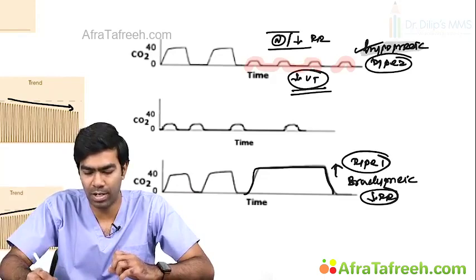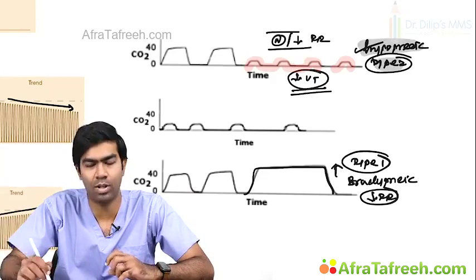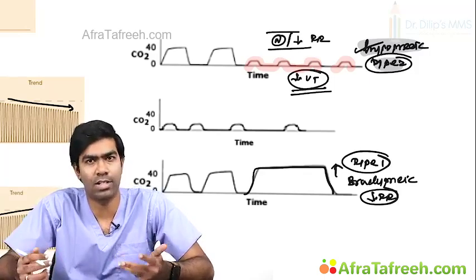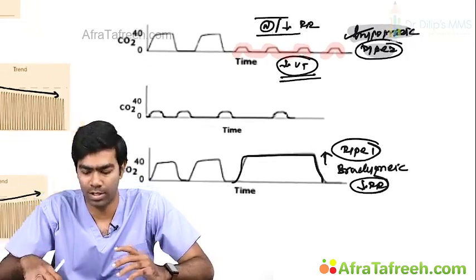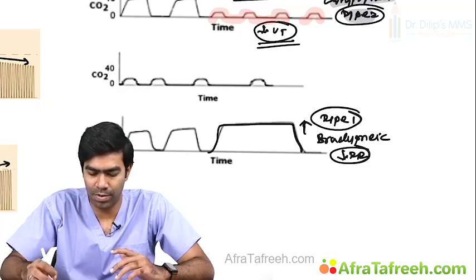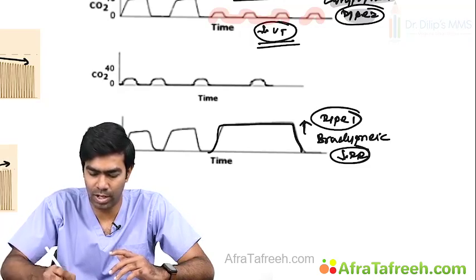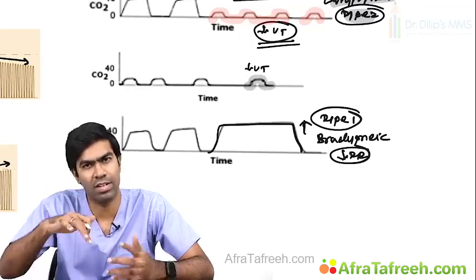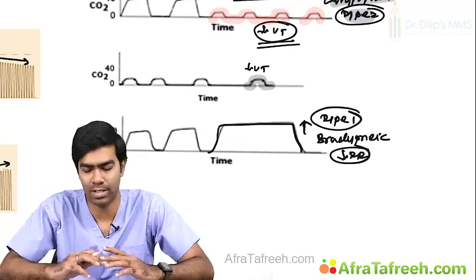This kind of hypopneic hypoventilation can happen if the patient is on excessive sedation, like excessive ketamine, during a surgery or critical care. So this is the third type of hypoventilation, where you can see there is a low tidal volume. That is the reason why you are having small breaths and a very small EtCO2 curve baseline.